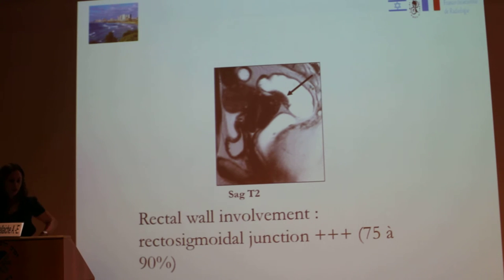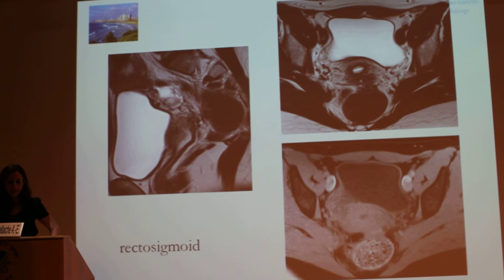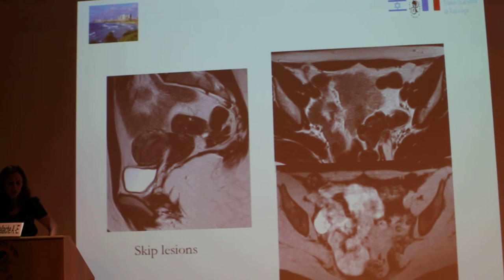For digestive lesions, here is a very beautiful picture, but in real life it is not like that because you have a lot of fecal impactions. It is quite easier to diagnose lesions on the axial plane because you can see that the lesion is in the same signal intensity as the myometrium. Skip lesions on the colon and sigmoid are important to diagnose — you have a lesion on the sigmoid and with T1 you can see a large nodule.